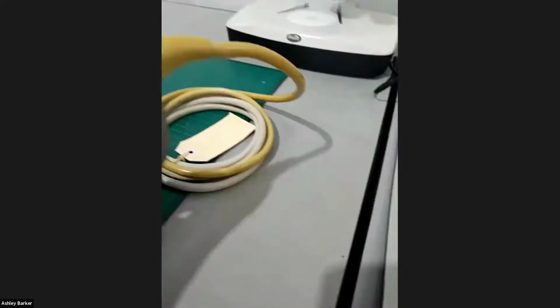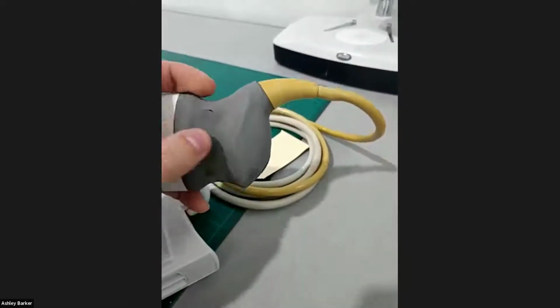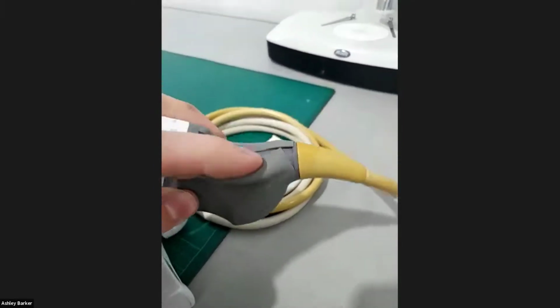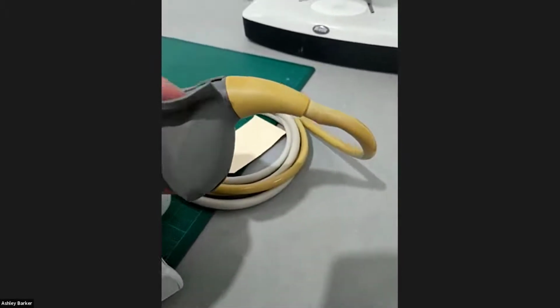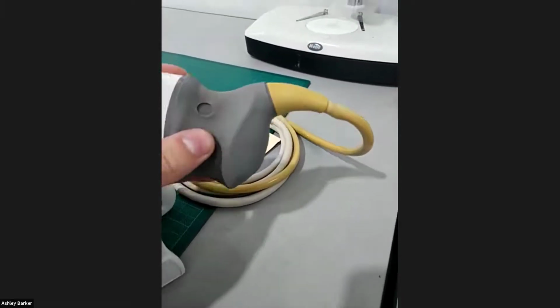Another thing is, I don't know if you guys tend to use these sorts of probes with those nice ergonomic handles with the wraparound silicone on them. But it's really common they start peeling off, as you can see there. Again, repairable and worth dealing with because they just get scummy and gel and horribleness underneath them.